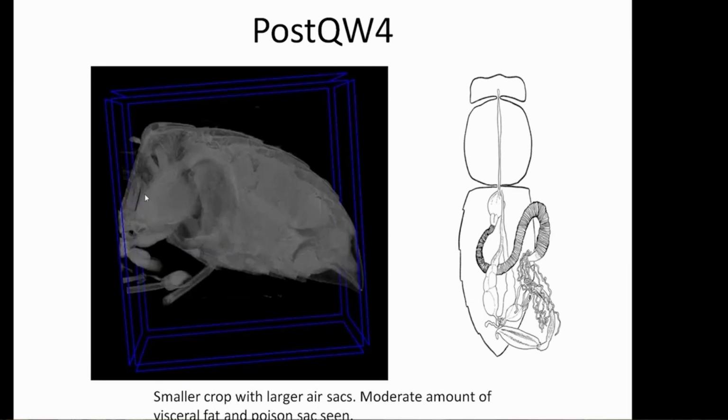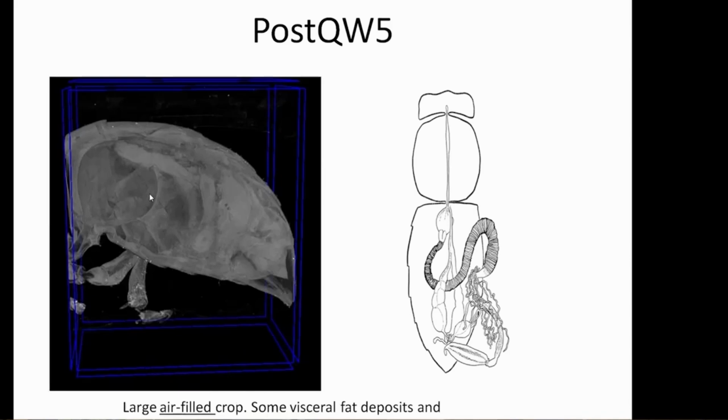A rather smaller crop. Now this time her crop is not full of water, it's full of air of low attenuation. If it had a burp, it would be very impressive indeed.